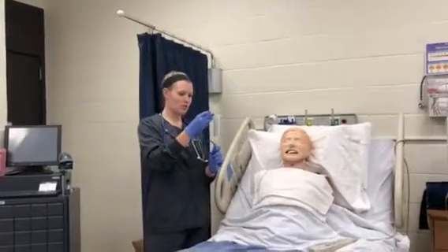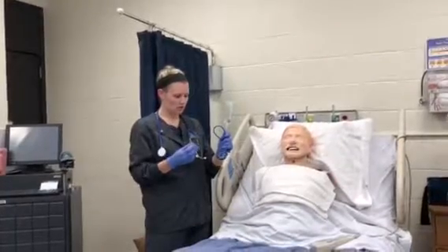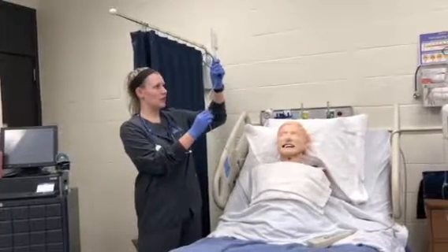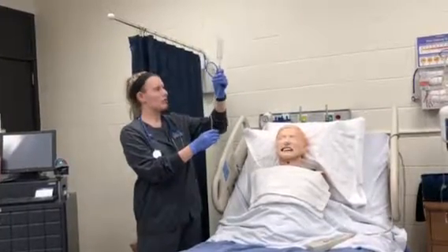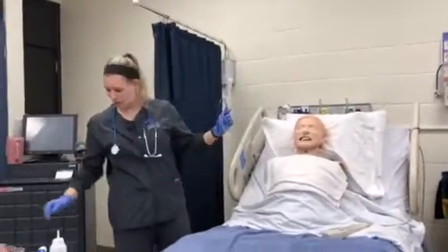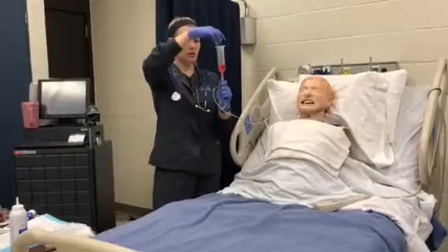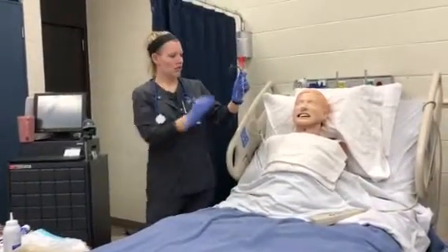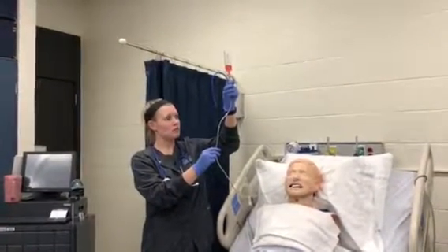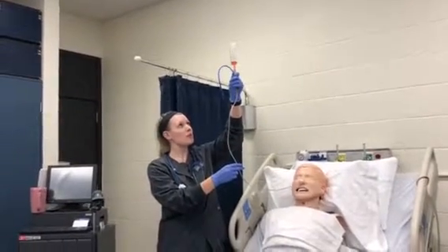So I'm going to flush and then let go a little bit so that it runs through. Might need gravity's help here a little bit. And then don't let your tube go dry. Clamp off so nothing comes back at you. Give your med. Give it a little bit of gravity and release so that it goes in, slowly but surely.